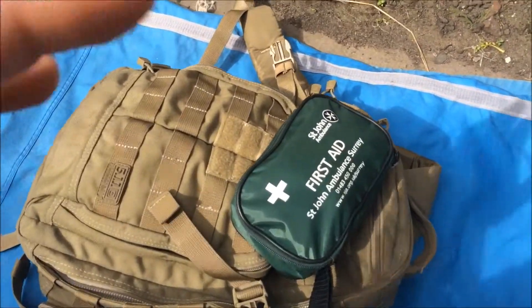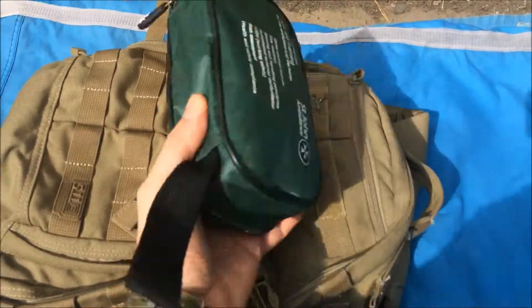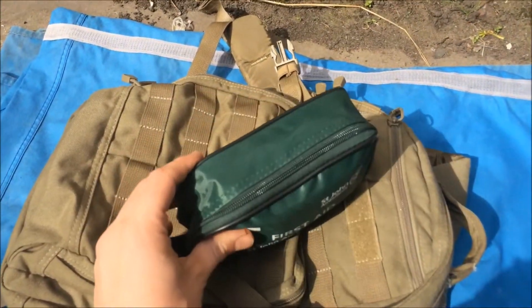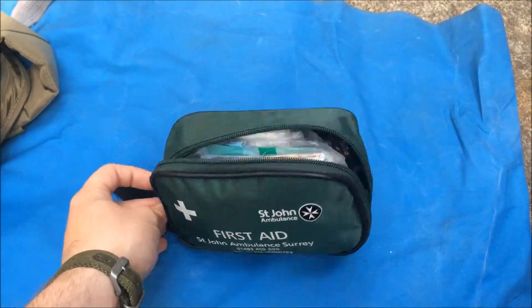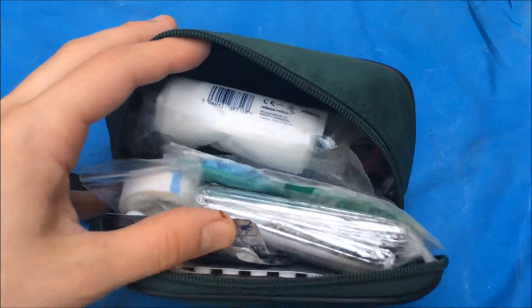Hello again guys, Super Kings here. I thought I'd just do another quick little video on my EDC bag — this is the first aid kit that I carry inside. I thought I'd just show you what's inside real quick. I'm just going to rattle through the items as quick as I can. It's not a major trauma kit or anything like that, it's just for bumps and scrapes, comes in handy.